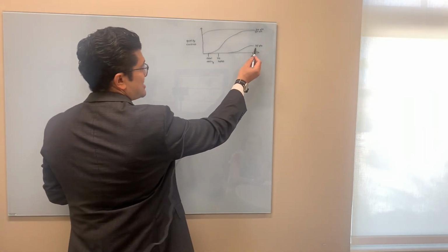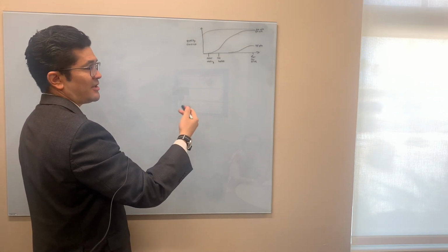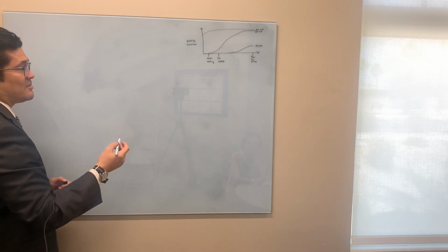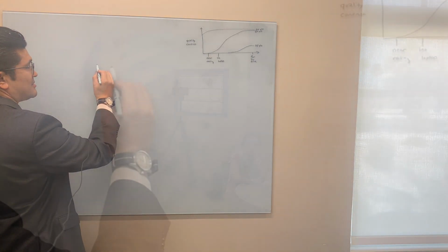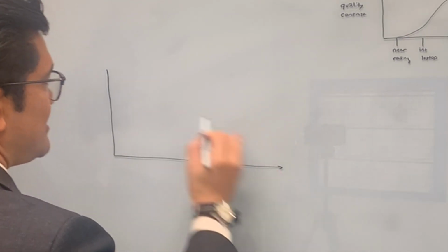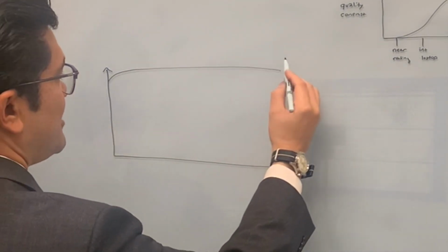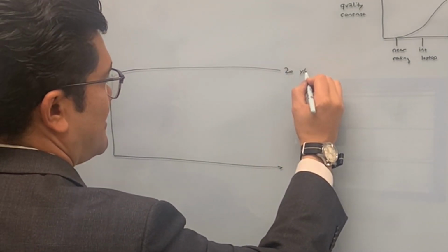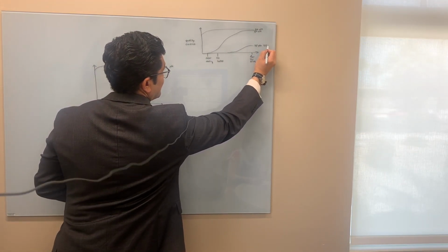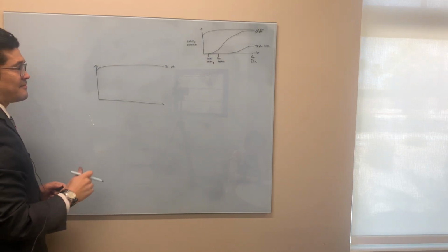Now we take that 75-year-old and we look at their lens choices for implants. Let's start with the basic lens. So how do I graph that? We're going to do the same XY axis. Let's put our awesome 20-year-old vision up here. We're going to take that 75-year-old with a cataract, and we're going to put a lens in there.